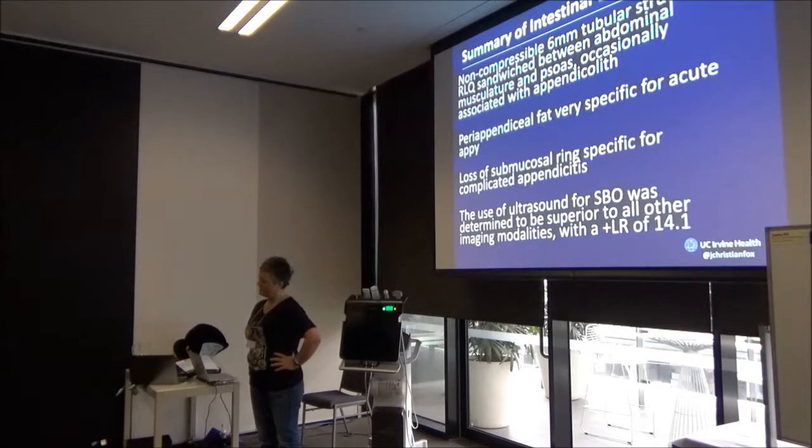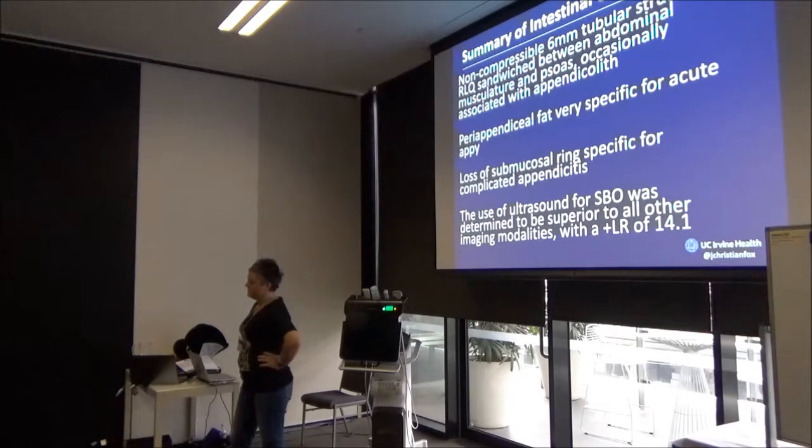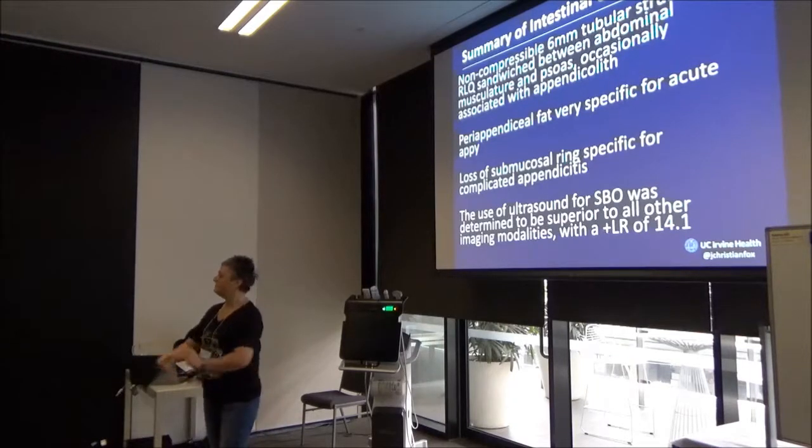Great question. So how comfortable are the surgeons? It depends who does the study a little bit, how confident the clinical sonographer was down in the ED, and also depends on the surgeon. But we can admit the patient to their service and start some antibiotics and kind of move the patient through the system. Surgeons come examine the patient, they see our images, and some of them will take the patient straight to the operating room. Some of them want CT scans. All depends on who the surgeon is and who the doc is in the ED.